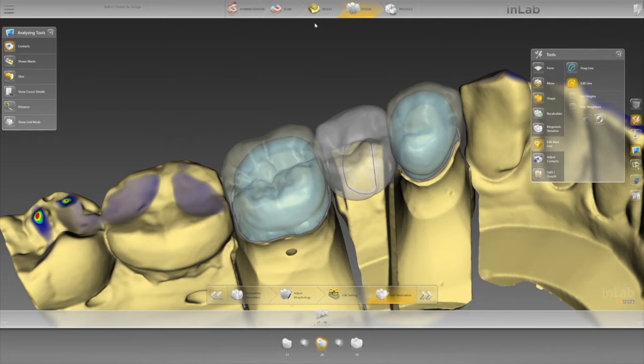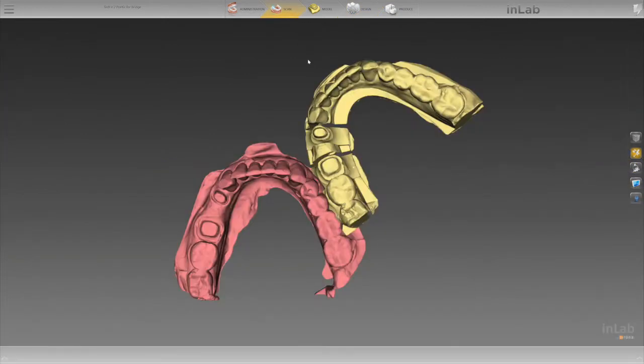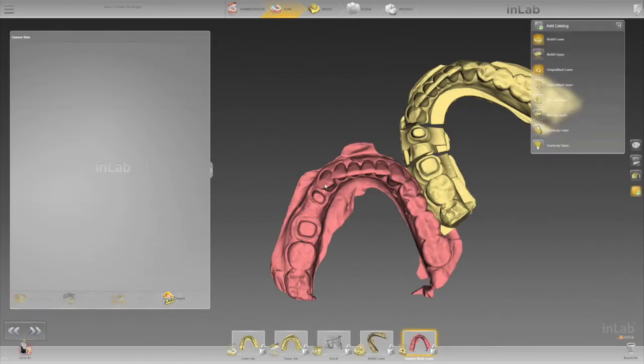Well, the solution is if you go back in your scan phase and simply take a solid model, and on that solid model, if you will scan the solid model in as a gingival mask, then you're going to now have your surface data.